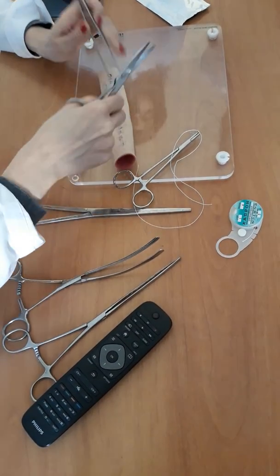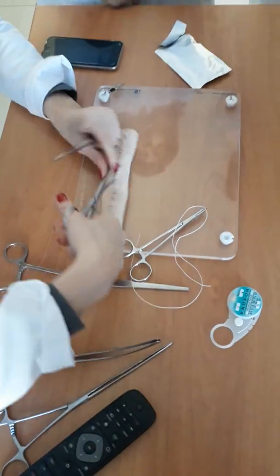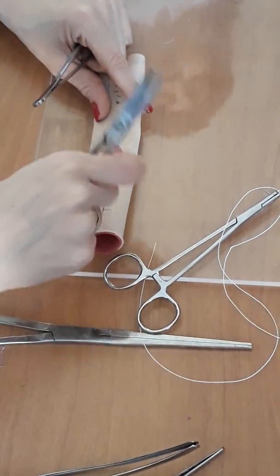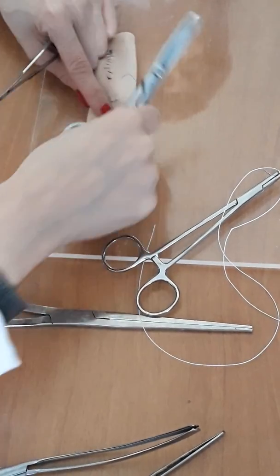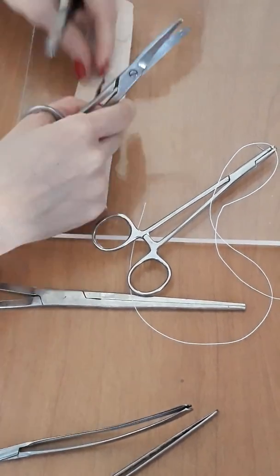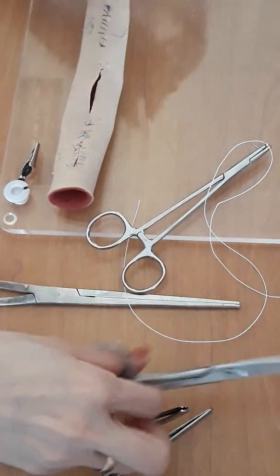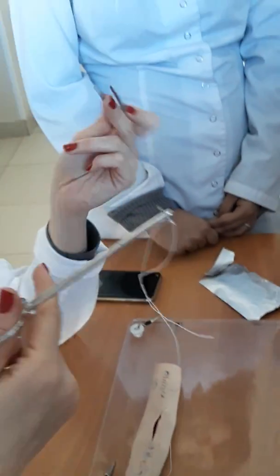intestinum. At first I will demonstrate it to you on the special equipment. In the next practical classes you should stitch a real intestinum yourself. It means you should have gloves. Okay. This is a model of intestinum. You should use the anatomical forceps, needle holder, the round needle. It may be an atraumatic needle.